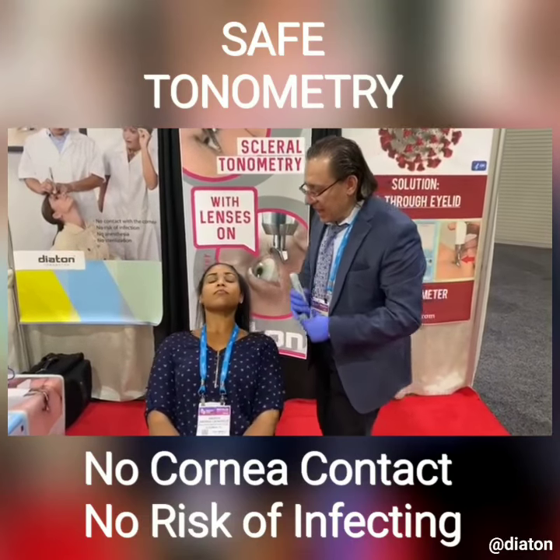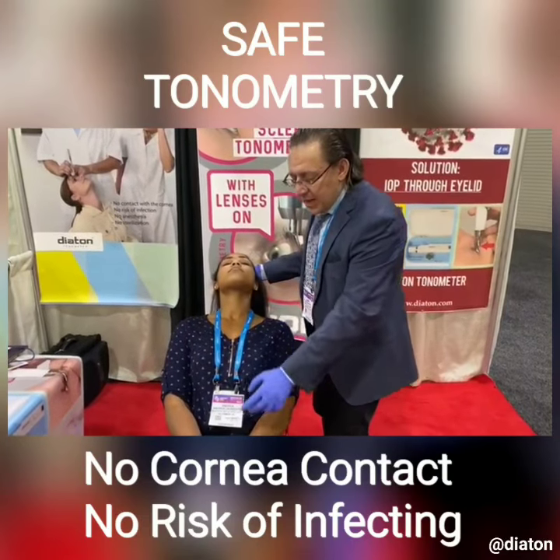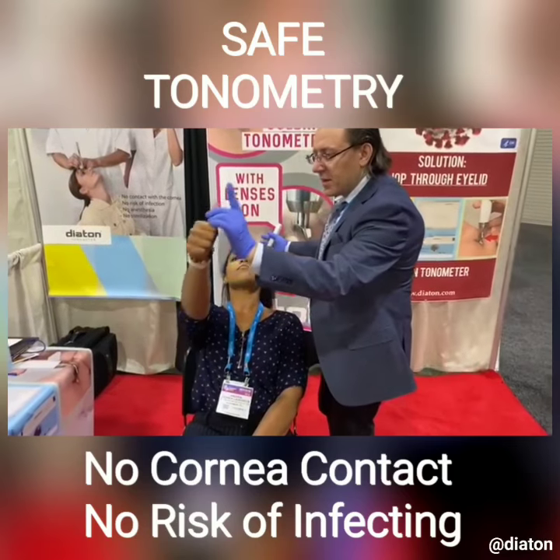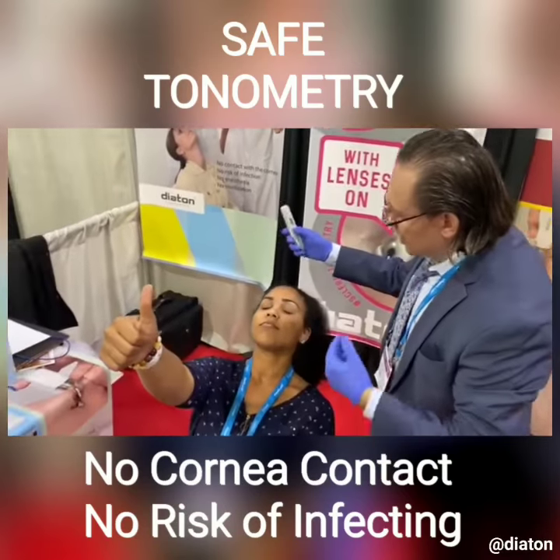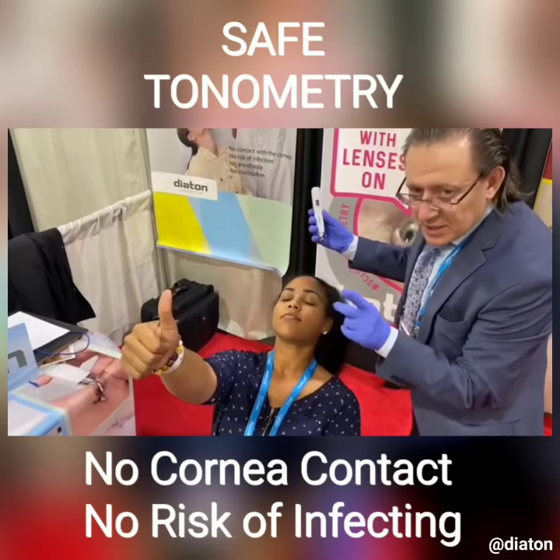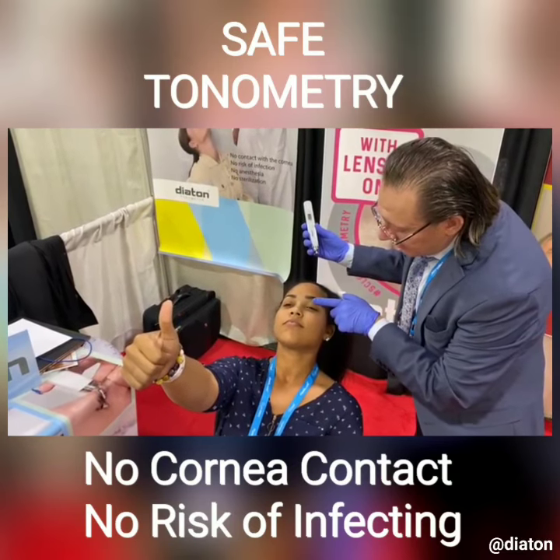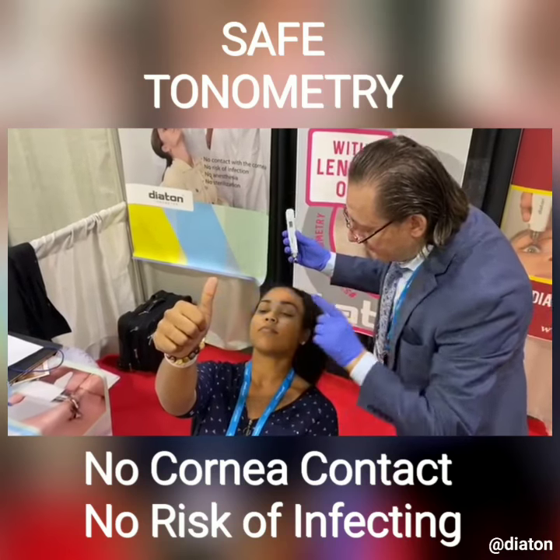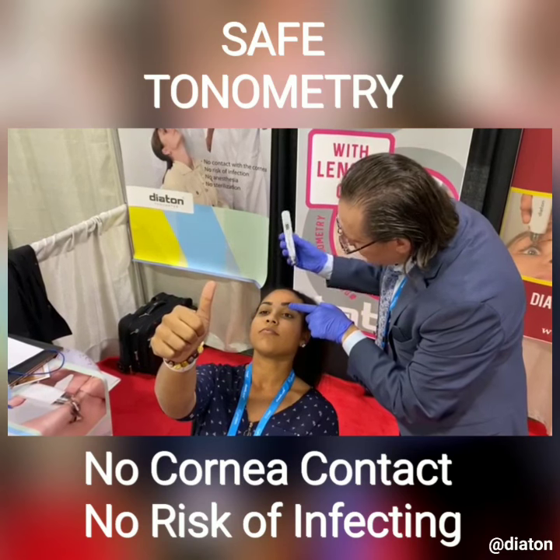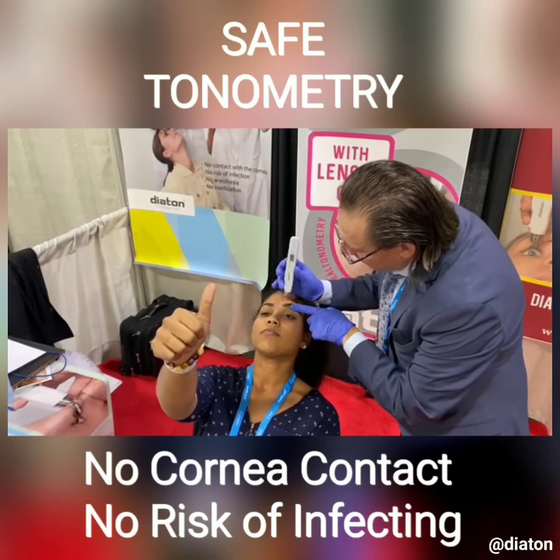Edge of the chair, tilt the head back and ask the patient to extend their thumb forward. Come a little closer. So this is the finger that will gently come in contact with the patient's eye. I would ask the patient to look at the finger. Gently fall into the lid. Use the edge of my palm for support.